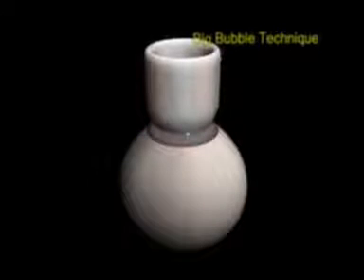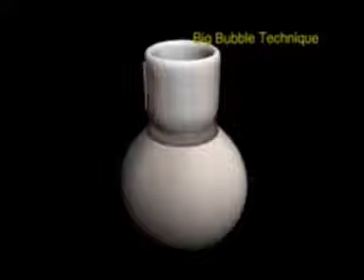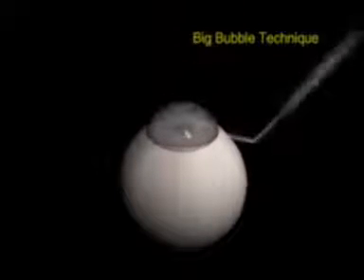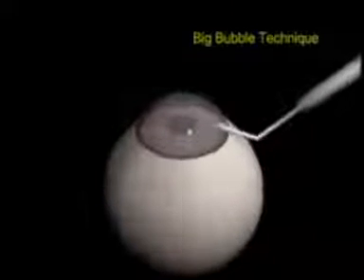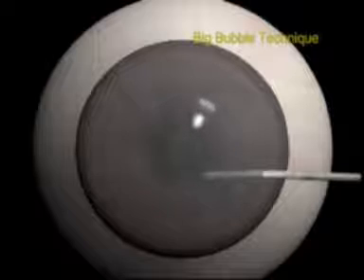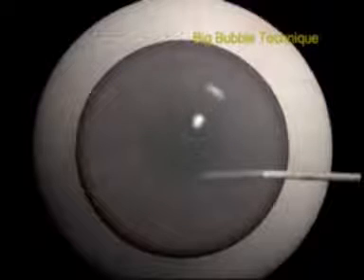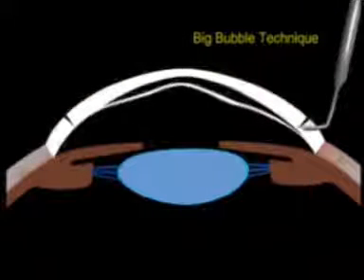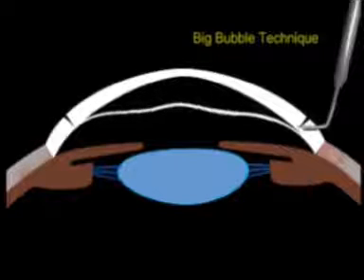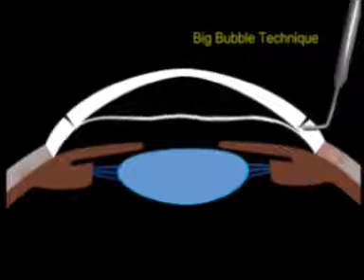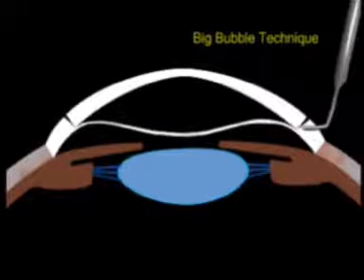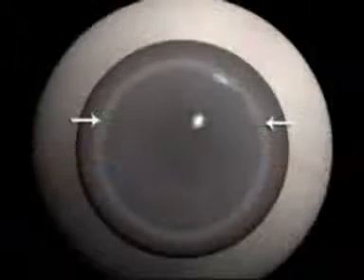First, partial thickness trefination of the cornea is performed, followed by injection of air into the corneal stroma at 80% depth using a 30-gauge needle. A large bubble of air collects, separating the Descemet's membrane from the stroma. The edge of this separation is visualized as a well-demarcated, dense white ring — the big bubble.